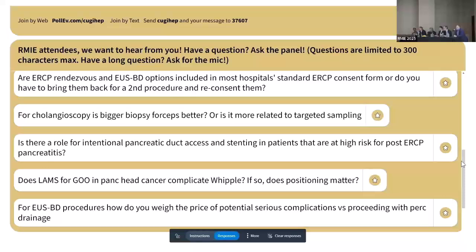Leave it there. If you look at double guide technique versus your primary cannulation, it's higher with primary cannulation. The double guide technique helps and assists by bouncing off, but you still have the best chance on your primary cannulation. So my practice is, if I've gone in once, unless I really predict that it's going to be difficult, I leave it there. Bring it back, I have a second attempt. Second attempt goes in there, I leave it there, because now on my third attempt, the data supports increased risk of pancreatitis, and I utilize it on that basis. But it is, again, case to case, and I'd love to hear from the rest of the panel.